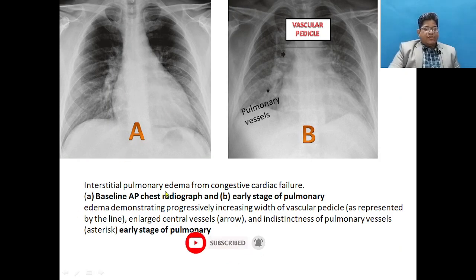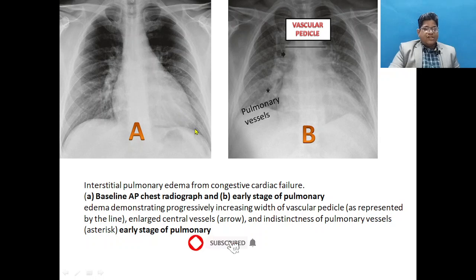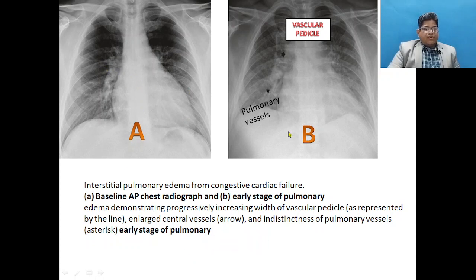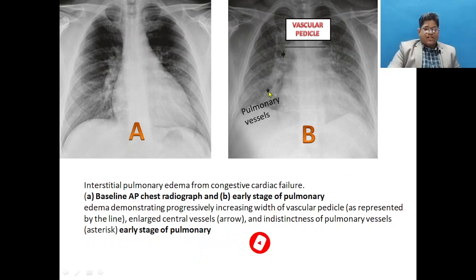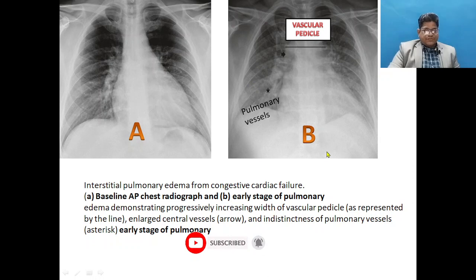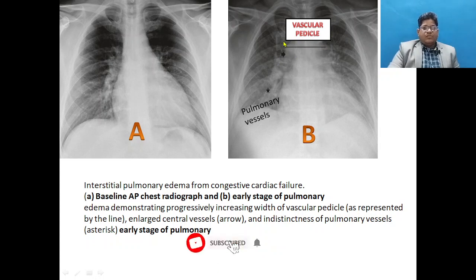Another X-ray shows interstitial pulmonary edema from congestive heart failure. The heart size appears abnormally large — apparent cardiomegaly — but it is an AP film, so it is difficult to comment definitively. In the early stage of pulmonary edema there is a progressive increasing width of the vascular pedicle, and indistinction of the pulmonary vessels. The central vessels enlarge, giving rise to a widened vascular pedicle.